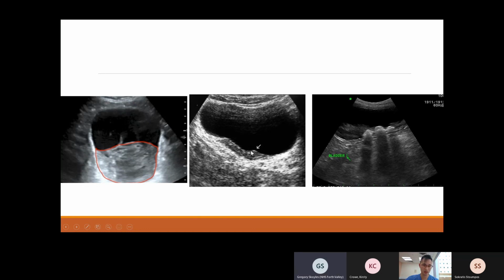So essentially, you've got something against the bladder wall that is abnormal, and this is a difficult one. But this guy has got bladder cancer. So this is cancer, and you can say, but Sam, that looks like the previous image when there's sediment in it. And you're right, it is difficult, and I think what will be helpful is to set the patient up. If the sediment changes position according to gravity, then that will tell me that that is sediment. If it doesn't, and it remains there, I know that's something that's adhered or connected to the bladder wall. This is cancer.